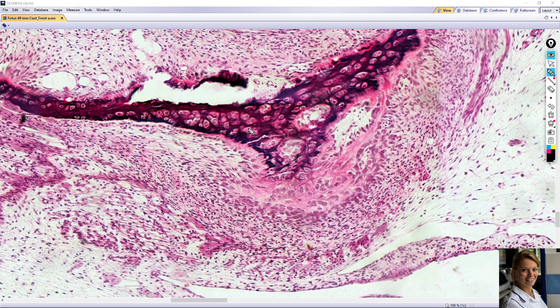Calcium phosphate is then deposited in osteoid tissue as it is organized into bone. Osteoblasts are trapped in the matrix and become osteocytes. Osteocytes you can see here, and the dark tissue is mineralized bone matrix, and osteocytes are inside the bone matrix. Osteocytes are spider-shaped cells that reside in small spaces called lacunae, and are connected with neighboring osteocytes by slender processes that lie in small channels called canaliculi.